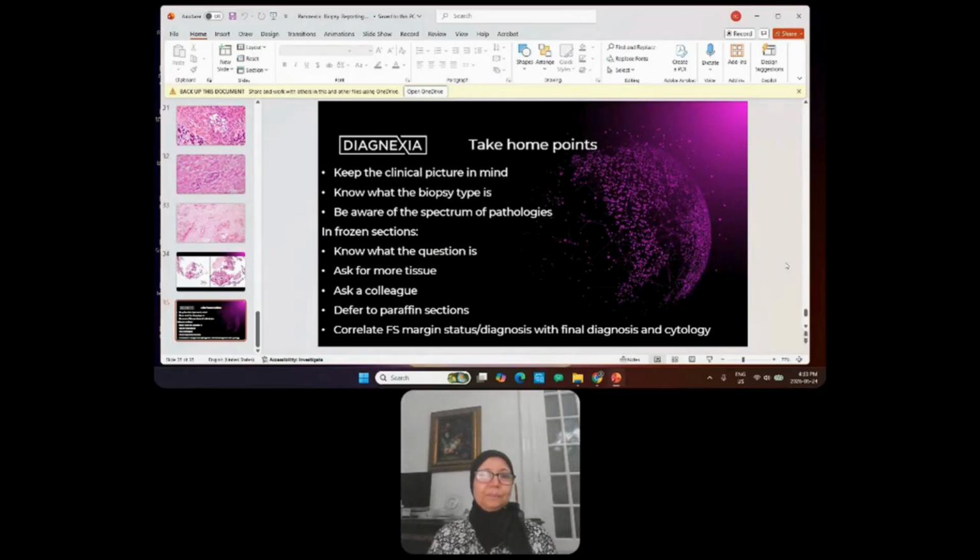No, I mean, no one finding in isolation should be taken into account. But generally speaking, if you've got single cells, then have a look at them, because remember, you can get atrophic acini, and the atrophic islets and the endocrine cells can look single file and infiltrative as well. So examine the cytology. If you have single cells embedded within a fibrous stroma, take a look at the nuclear features.